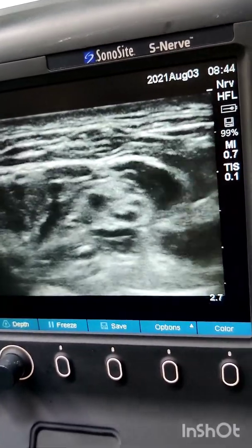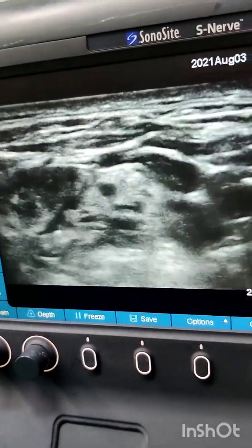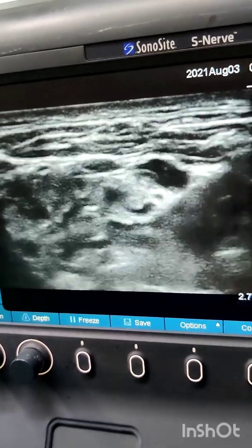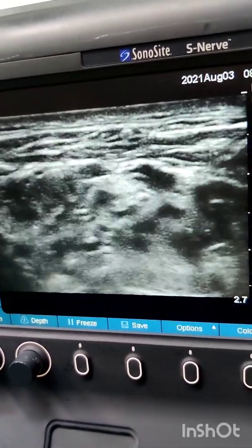Aspirate before each injection to confirm negative aspiration of blood or any other body fluid. Do not inject if there is any resistance or pain on injection, as you would be too close to the nerve or even maybe intraneural.